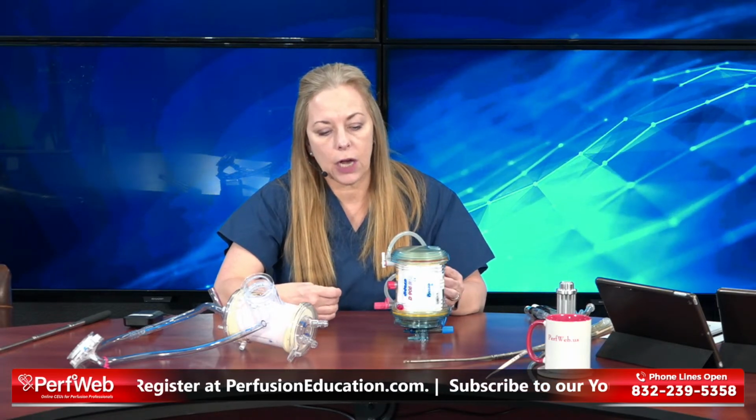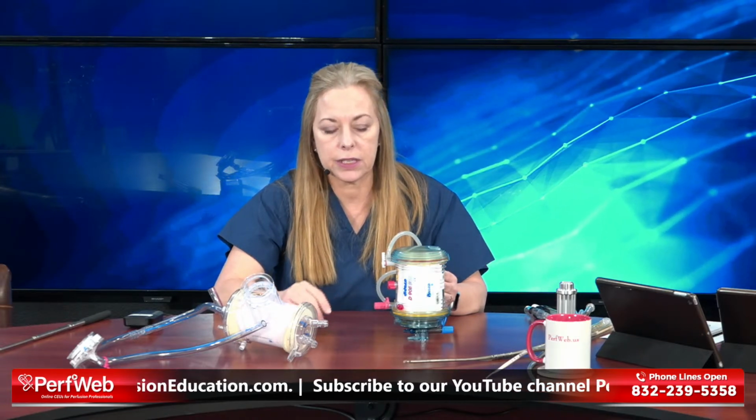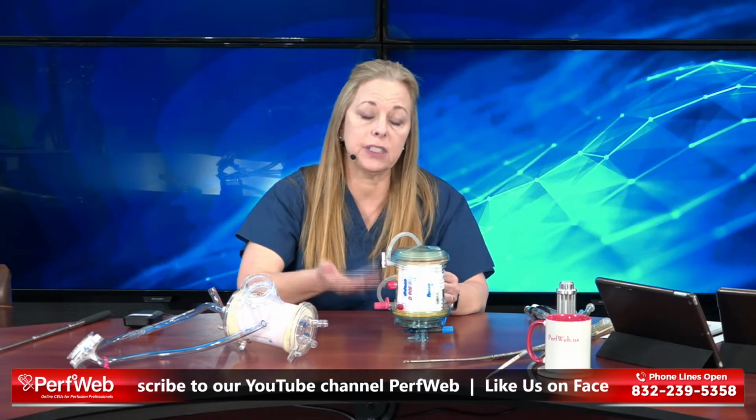We like to keep ours open throughout the entire case, and then we use it as a way to get post-oxygenator blood back out if we're needing to maybe incorporate a CRRT or something, or just as a way to make sure that we have a method of de-airing if we got into any sort of situation like that.